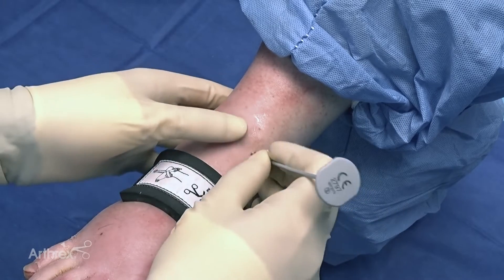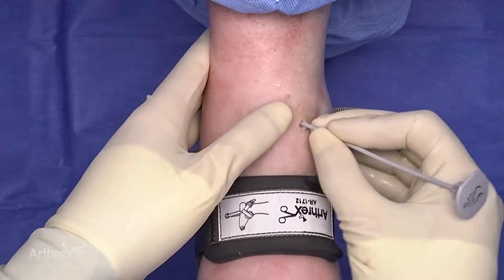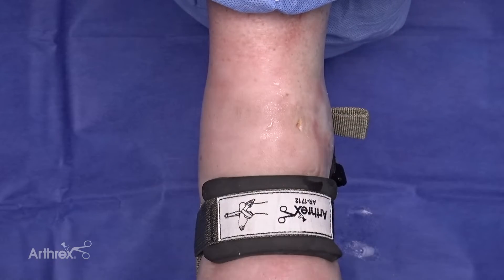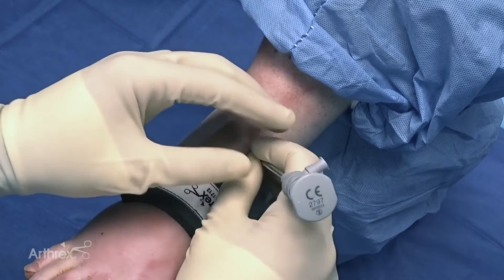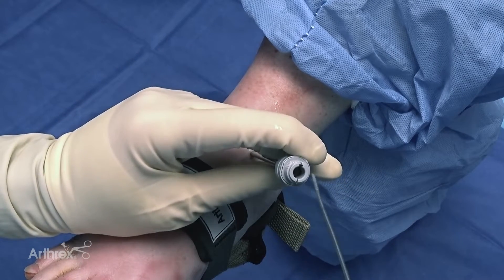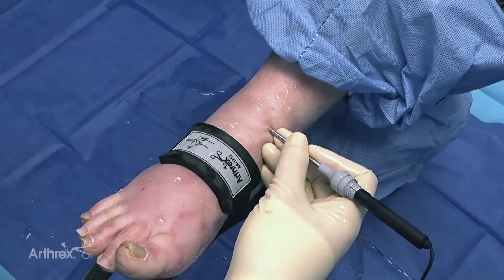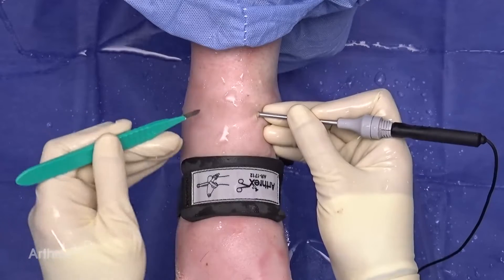I like to first insert the obturator so that I can feel that I'm in the joint, then remove that and place it into the trocar. I insert my obturator with the trocar into the joint, remove the obturator, and insert the Nano Needle until we can begin to see some cartilage and know that we're in the joint. Then I can direct the scope laterally to where I can feel it, and I'll make my second portal.